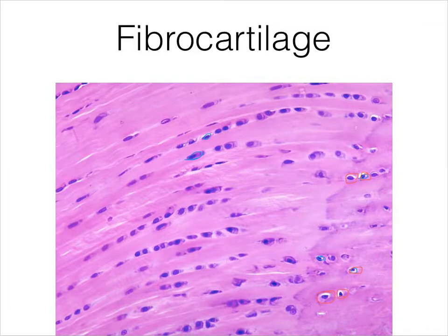But we also see fibrous, usually though not always, pink collagen fibers running relatively parallel. In fibrocartilage, the nuclei are usually more oval shape and less flat because they have these lacuna rooms to sort of expand into.